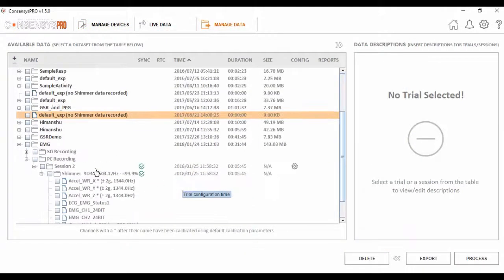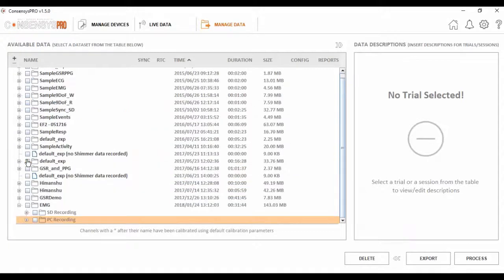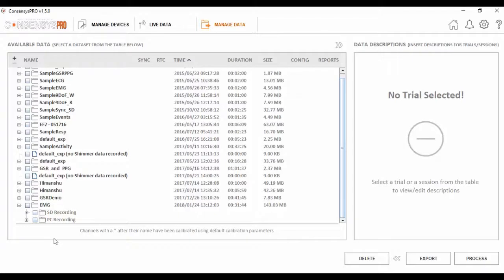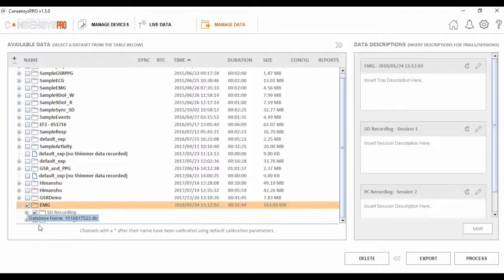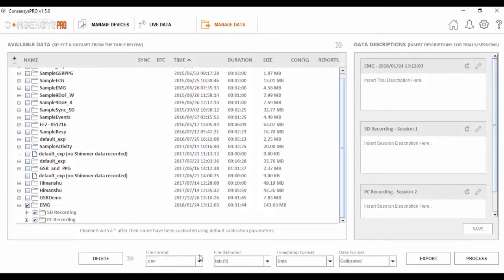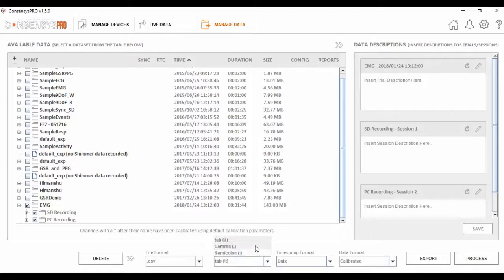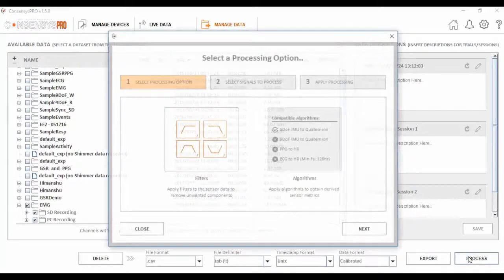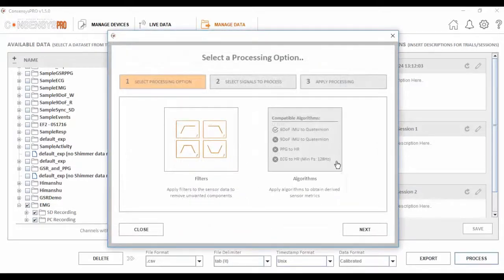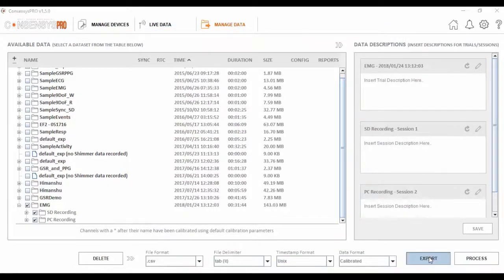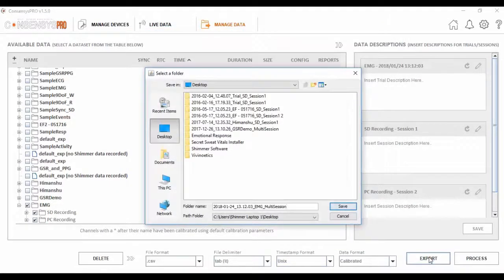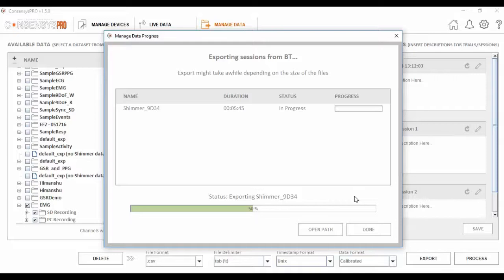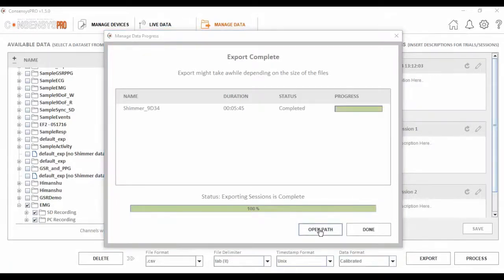On completion, you will see the data is now in the Manage Data tab. So for the trial EMG, I have two datasets. One as we mentioned with the live PC recording, and the other with the data from the SD card. The final step is to export the data if we wish to process further in advanced data manipulation programs, such as MATLAB for example. We select the trial or trials we want to export. The raw data can be exported in a number of different data and time formats to the user's preference. Also at this point, filters and algorithms can be applied to the data if appropriate. Finally, we can see the data has been exported, and is available in a local folder on your PC.